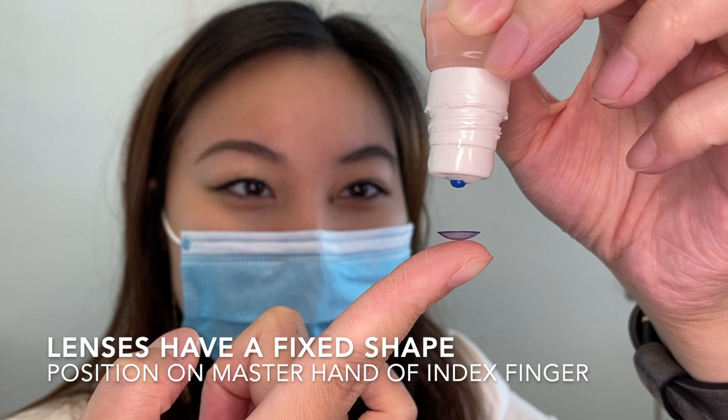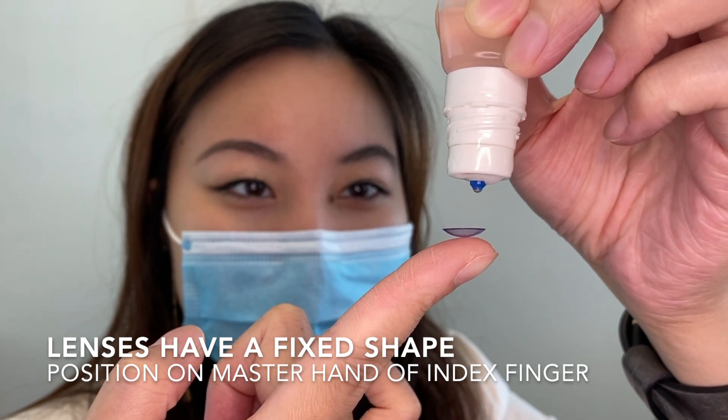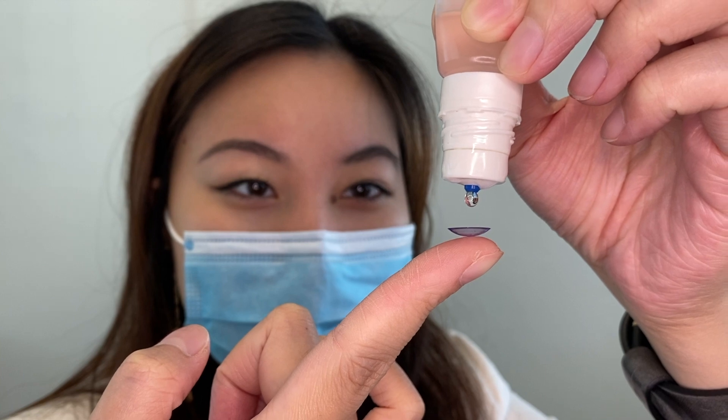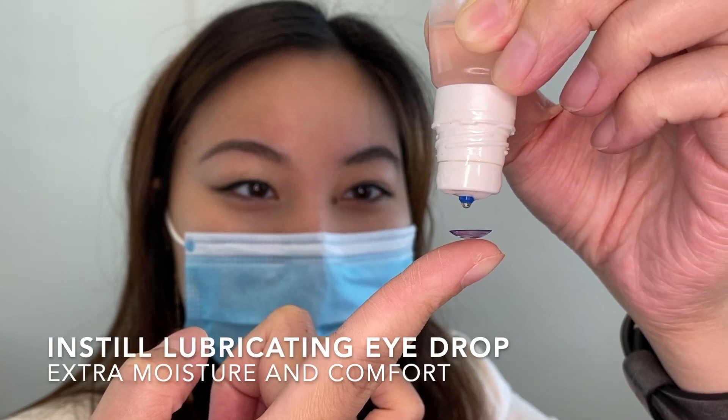These lenses have a fixed shape. Position the lens onto your master hand's index finger like a bowl shape, and instill another drop of artificial tears for extra moisture and comfort as you wear them.